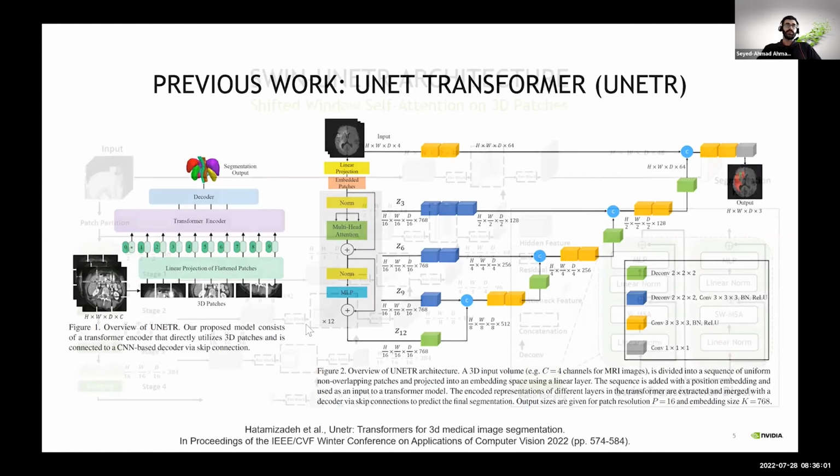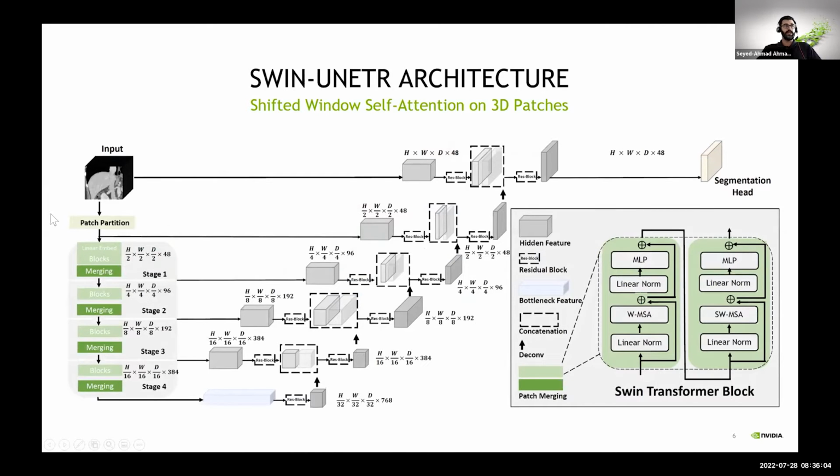So the SWIN UNETR architecture is very similar to the UNETR architecture, but it follows this multi-resolution step a little better. In the fine resolution layer, you actually have quite a lot of patches that encode very fine-grained structure and local structural spatial context, whereas in the lower parts of that pyramid, you get increasingly larger blocks or subblocks of the volume to learn the multi-head attention. But similar to the UNETR architecture, the encoded representations get forwarded to a CNN decoder towards the segmentation output map and the loss for segmentation.